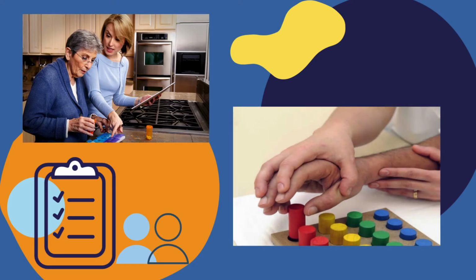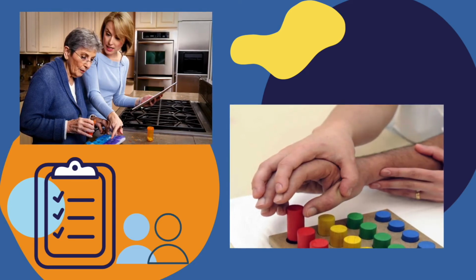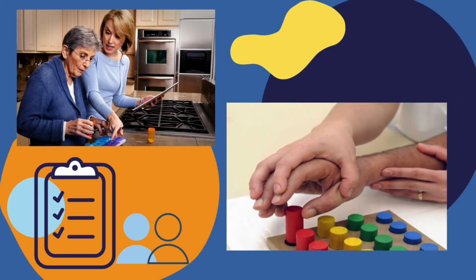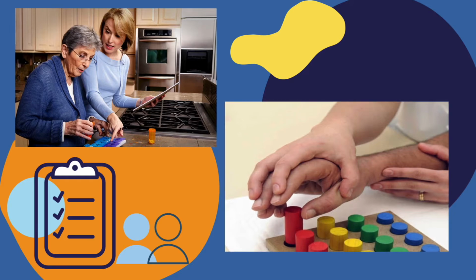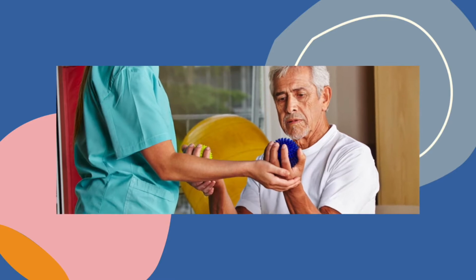Throughout this exam, we are also checking control of voluntary movement by examining subject's dexterity response, specifically assessing how well the subject is able to switch from one task to another and manipulate objects. This test is also addressing motor control by assessing the coordination of joints and muscles in the upper extremity.